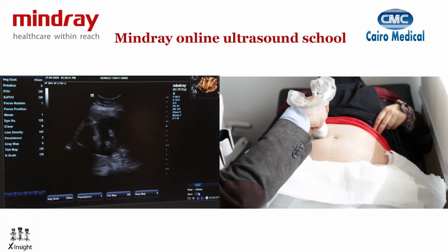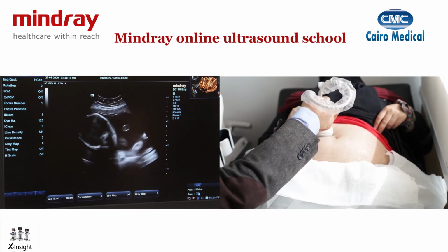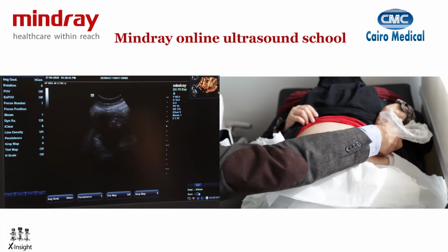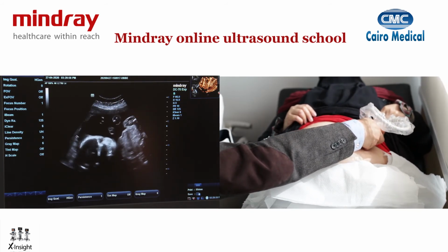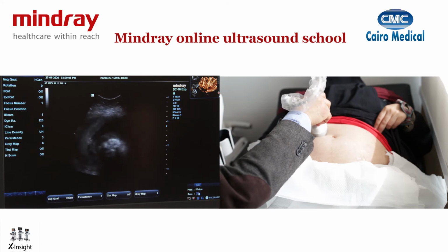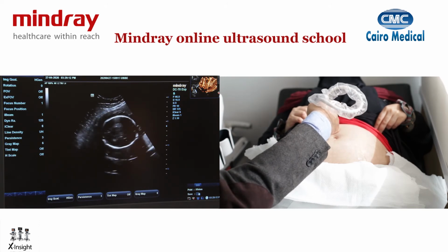Let's do it again. So put the probe longitudinal, see the midline echo, move 90 degrees, and then I'm going to move across the mother's abdomen to try and get the face to face upwards, as you can see here. Obviously, you're always working against a moving target, so the best thing to do is to go back to your starting point. So again, if I can't get it, put the probe longitudinal, see where the midline echo of the brain is, move 90 degrees angle, so we're getting a view of the baby's skull.